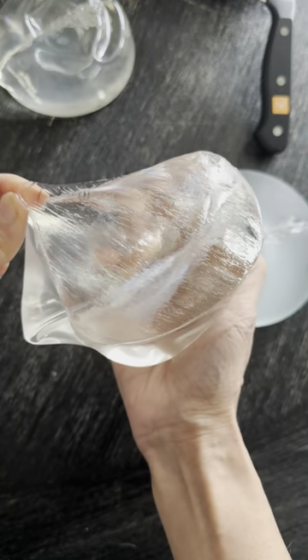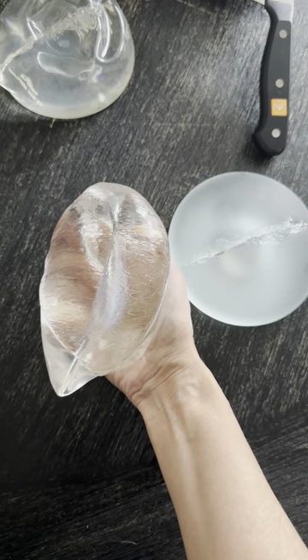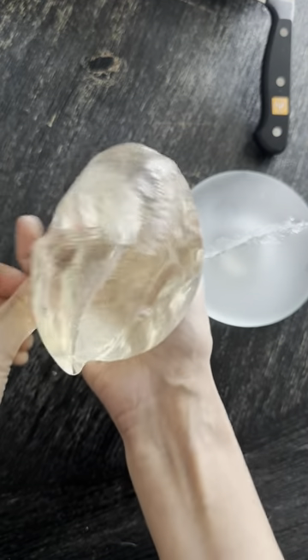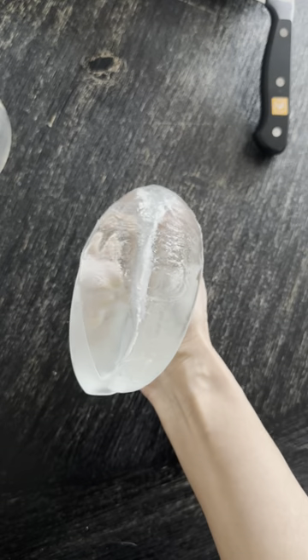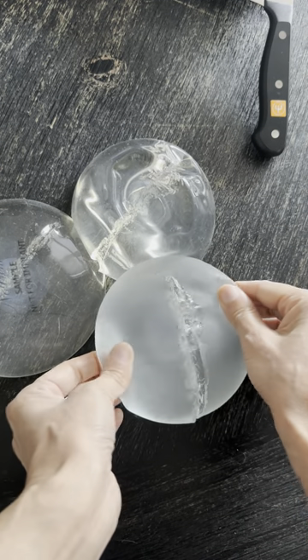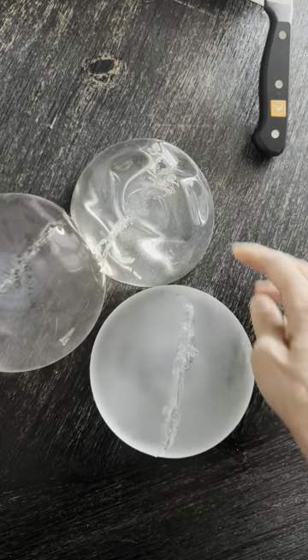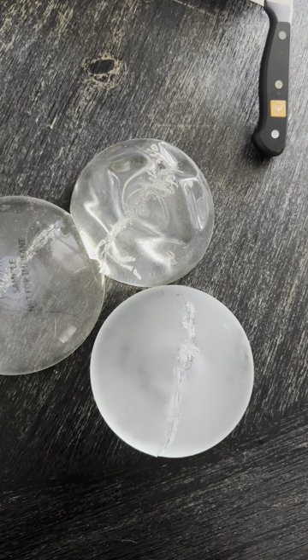With the Natrelle implant manufactured by Allergan, yes you can also separate the shell from the gel, as you can see. So of the three — this is Allergan/Natrelle, this is Sientra, and this is Motiva — there's not a dramatic difference between these implants, frankly. I was expecting a bit more of a difference with the Motiva implant; I was expecting it to be even more solid than it is, although it looks pretty good overall.